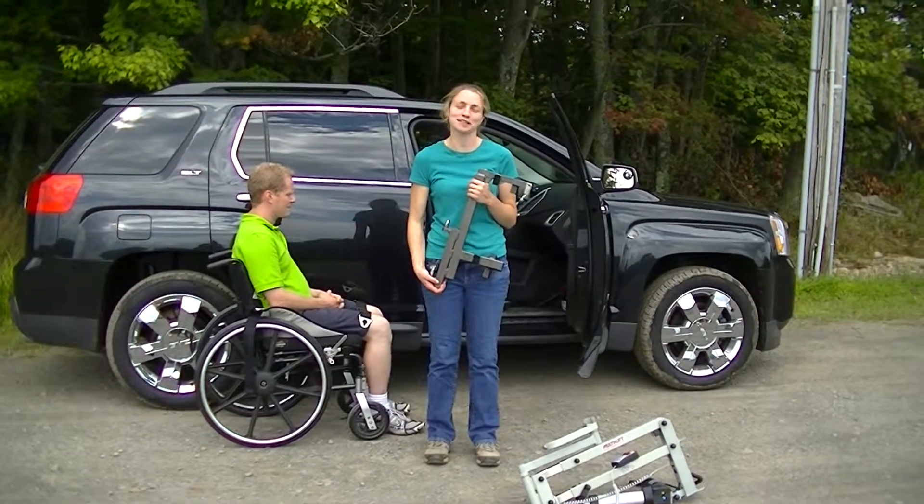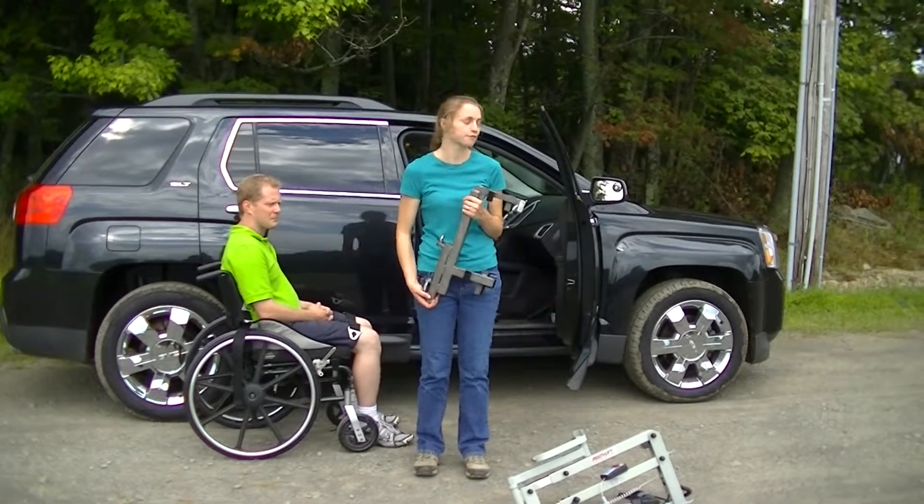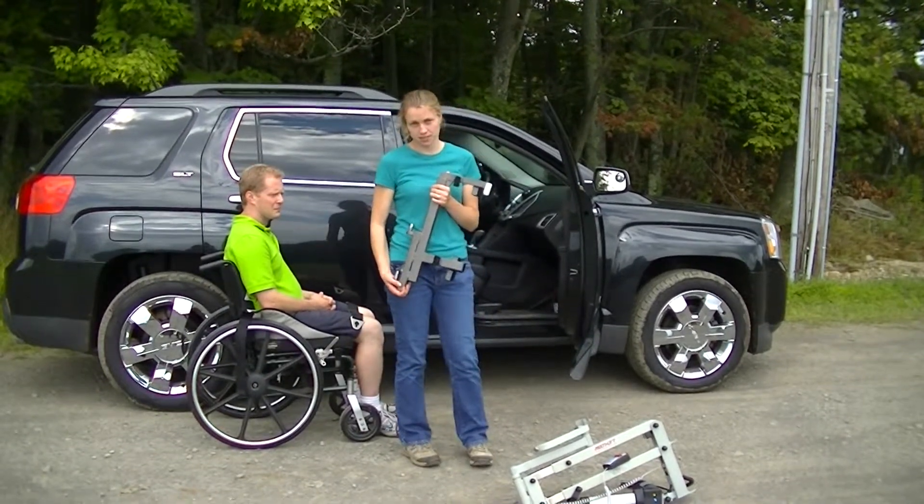Thank you for joining us today at Access Unlimited. We're looking at the use of a multi-lift with a speedy bar for a 2010 GMC Terrain.